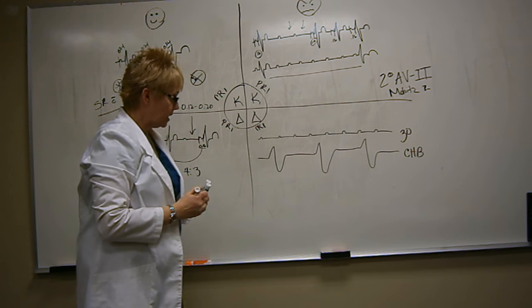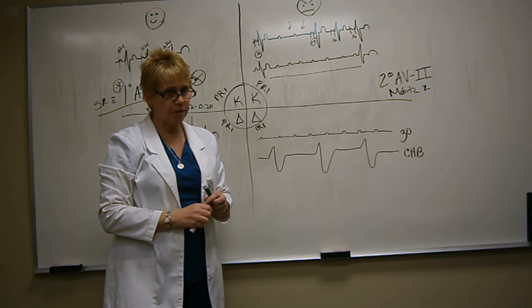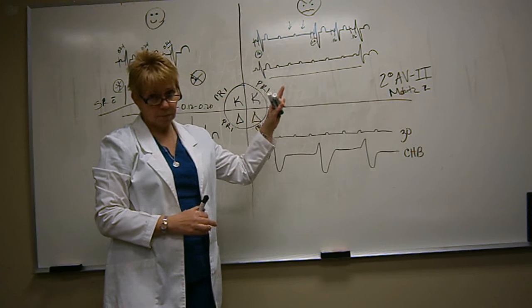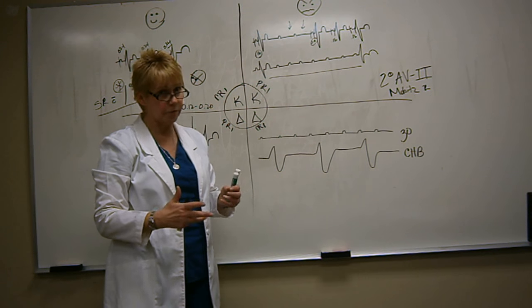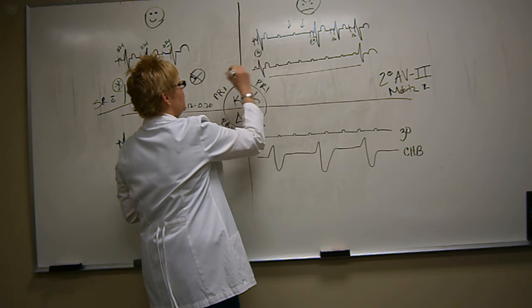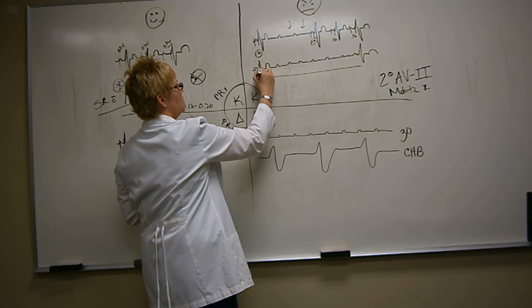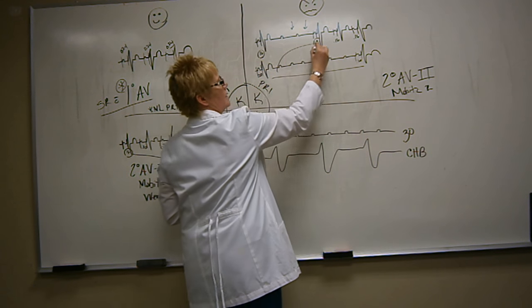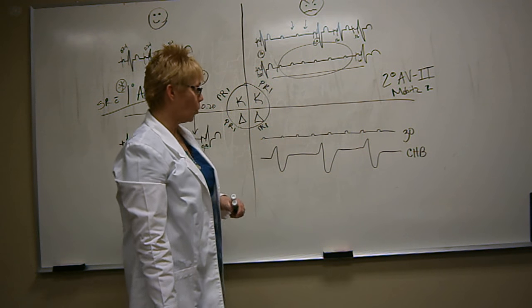And I've actually seen a patient on one of the units where I work at the hospital that had about 11 P waves between their R to R waves. So if you can imagine, maybe their atrial rate is firing at around 88, but that ventricle is firing at about a rate of 10 or 11 beats per minute. So you can see, if you consider the same information, the PR interval on this strip, let's say it's 0.20, this one here will be 0.20. But this is the problem with the second degree type 2. So second degree type 2 or Mobitz 2.